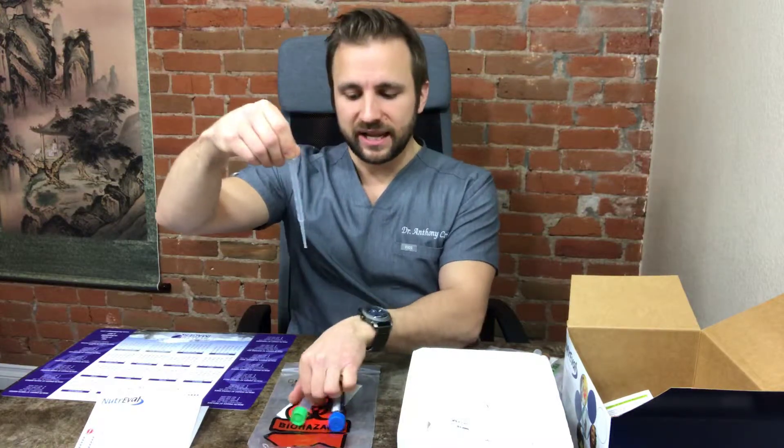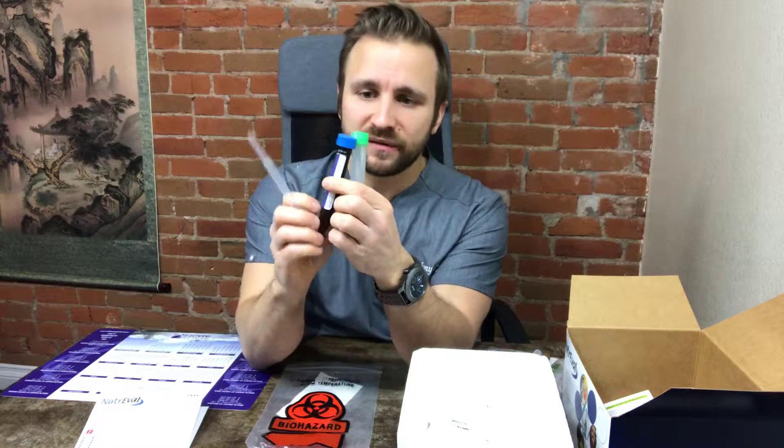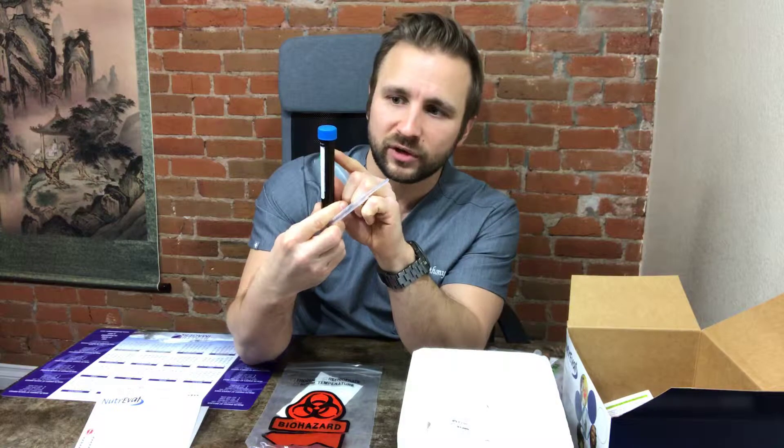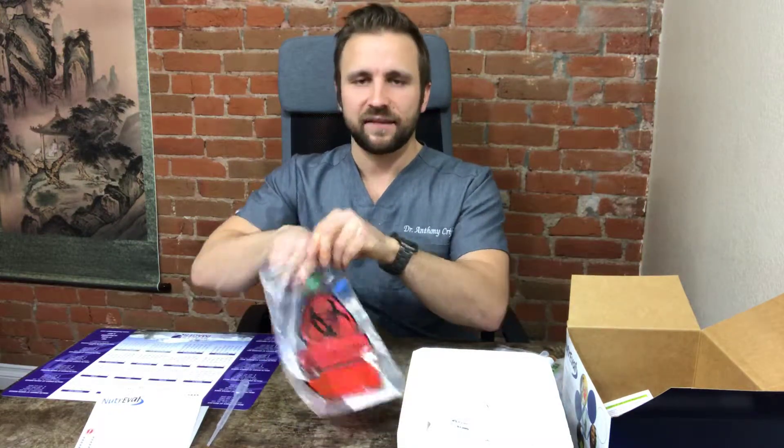What you're going to do is find a very clean container, or buy a plastic disposable cup from the store. Urinate into that container, then take the pipette and pipette the urine into the two tubes. Make sure you fill them up as high as you can — fill the blue top dark bottle to the 13th or 14th mark, and fill the green one nearly to the top. Once done, place these in the bag and put it in the freezer with the freezer brick.